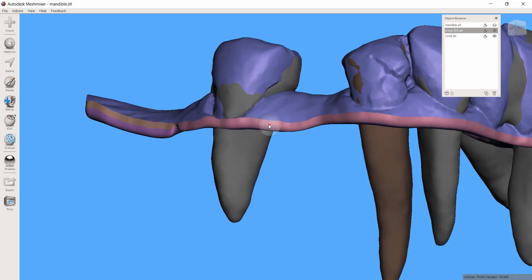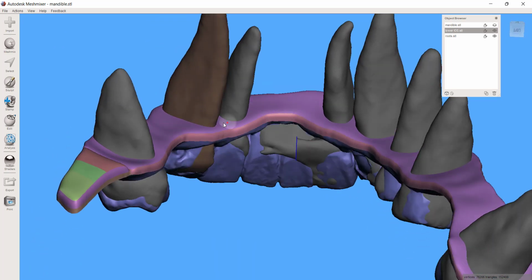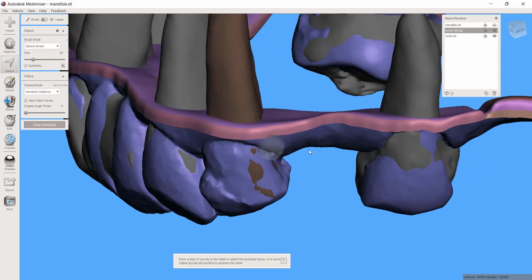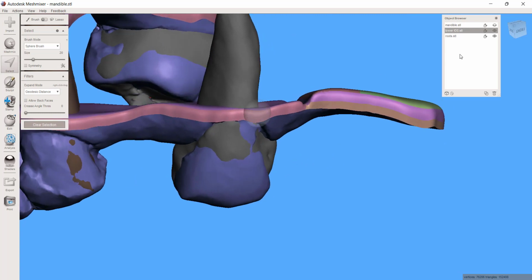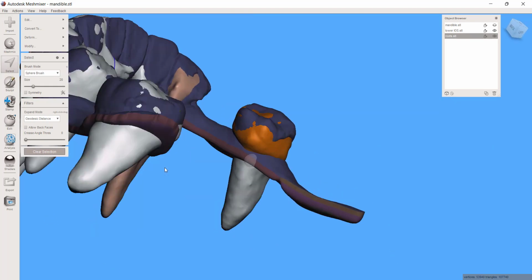So what I would ideally like to do is take everything that is above this transition where it joins into this model, everything above that, as far as crowns of the segmented roots, I just want to get rid of them. Okay, now I can do that in a number of ways. Let me do it both ways, and you can just pick which one you like. I could select the roots, and I could just manually come in and cut those out. All right, make sure you're not picking up any portion of that root.